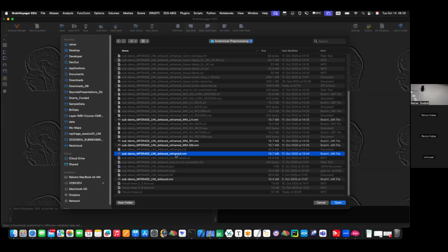That's true. It's a bin file, right? I tried to load it and it didn't work. So I'm going to close this again because it happens when you open it. If you restart from Voyager Edu, it's not opening in mine either. I come to you in a second. So just restart it, and then in this initial window that pops up, down here there is add more data sets, and then you browse to the place where you've extracted this bin file. First you need to do something. So go to that place.